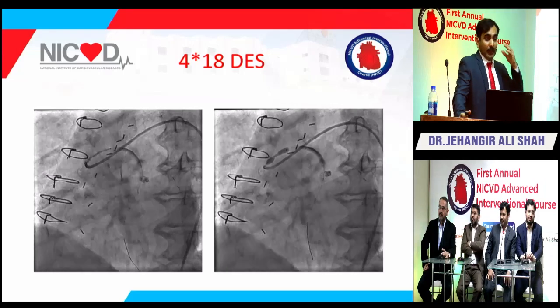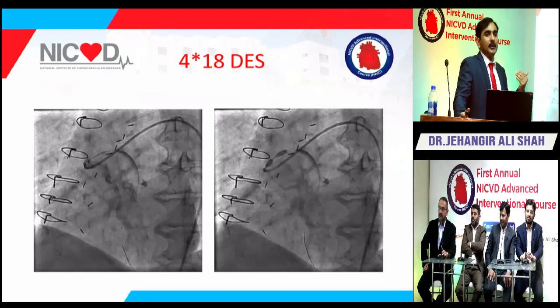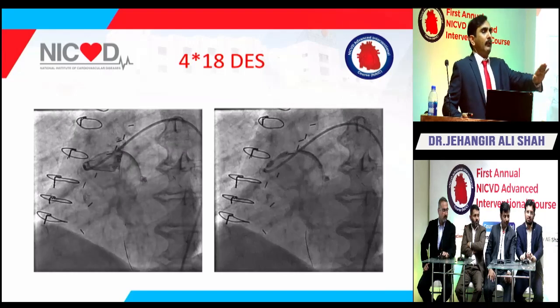One thing is you just miss the ostium, you overshoot the ostium and you put a stent in the aorta. Jahangir, can I add a few comments on it?